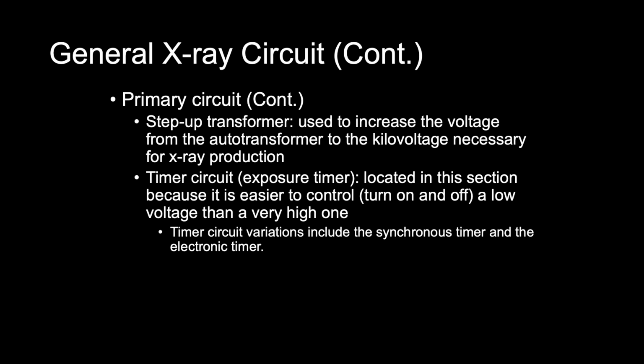Once the capacitor receives its pre-programmed charge, it terminates the exposure. The time it takes to charge this capacitor to its pre-programmed level is controlled by the variable resistor. To achieve a 1-second exposure, the resistance is increased so that it takes longer to charge the capacitor. This includes the inherent electrical delays, which is a total time of 1 second.